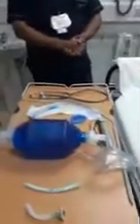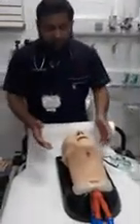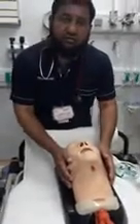If any patient becomes unconscious and has an airway problem, what do we do? The airway starts with the basic airway and positioning first of all. This is the mannequin and this is supposed to be a patient. The position is very important. First of all, hello, are you okay, sir? If the patient is not answering, it means that the airway is a problem.